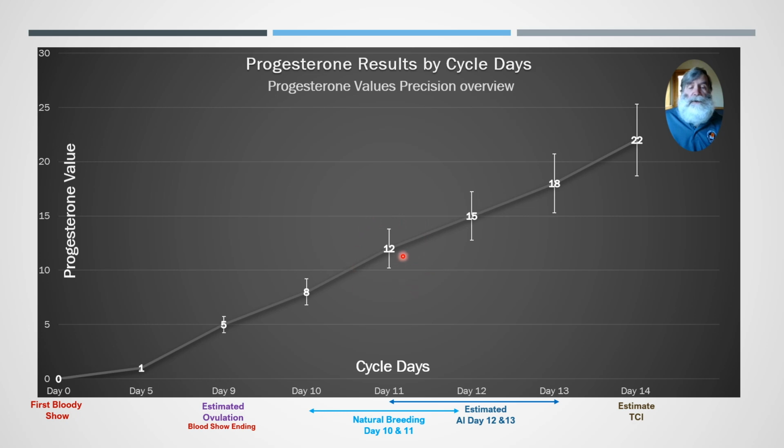So just in summary, a 12 would actually be a functional range of 12. This is just an example. Every instrument's different, could be wider, could be tighter. A 12 would be 10 to 14, which would be a functional range, which means your instrument's working just fine. If you ran it 5 times, you might get a 10 the first 2 times, you might get a 14, you might get a 12. All of those are totally acceptable. That's totally expected when it comes to statistics.